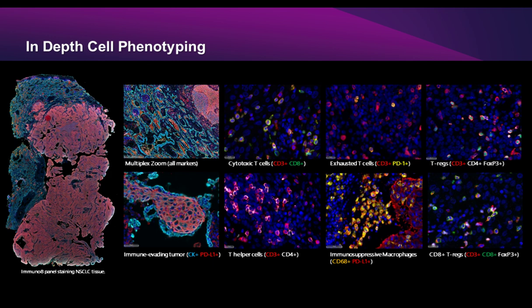Thank you both. Can this multiplex IF be applied on cytochemistry? I have a lot of experience doing multiplex IF on cytochemistry preps, and I haven't actually tried Ultivue technology on it, so I would be curious what Katir would say about it. But in my experience with multiplex IF on cytochemistry, it's highly dependent on how the samples, or cells rather, are fixed and prepped.